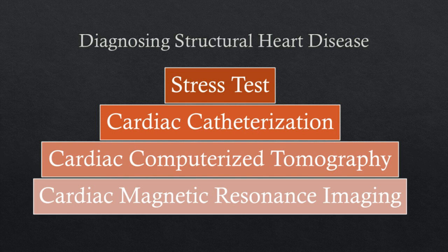A cardiac MRI is also a test that may be ordered. And for this test, you will lie on a table inside a long tube-like machine that produces a magnetic field. The magnetic field produces pictures to help your doctor evaluate your heart.